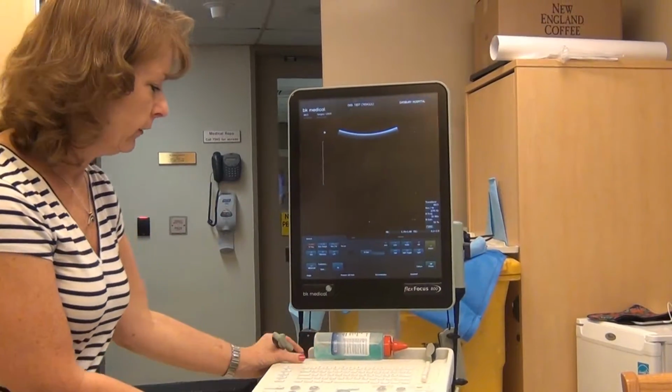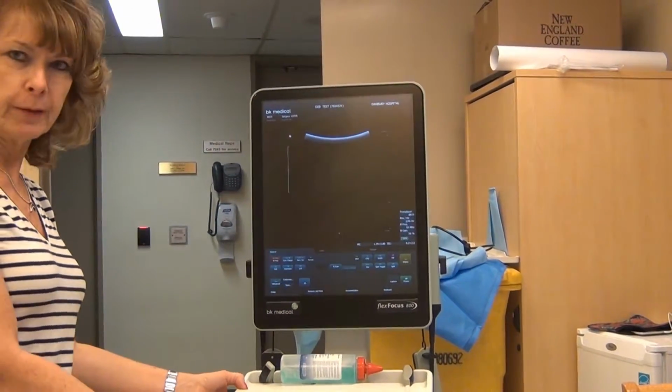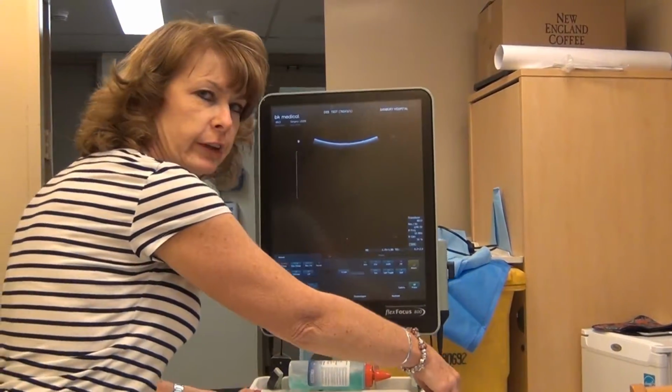Okay. Now let's just go over the system a little bit. I'm going to lower this down here.